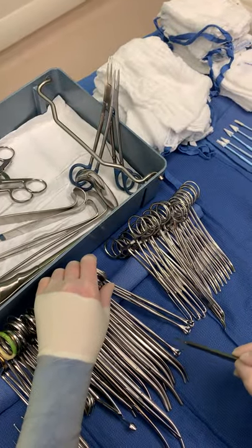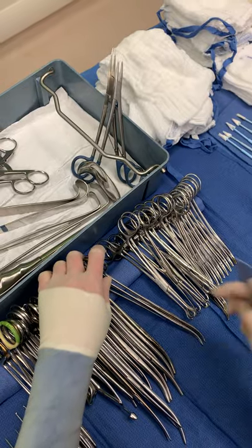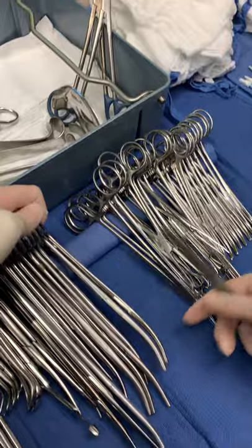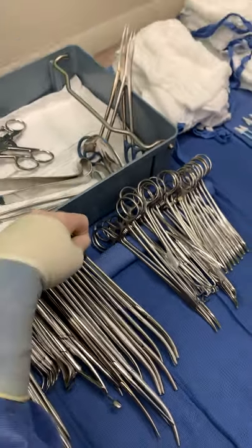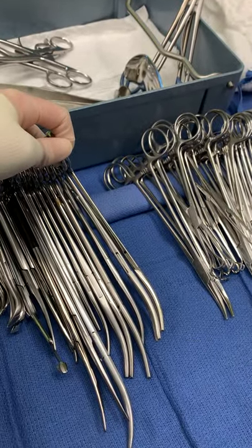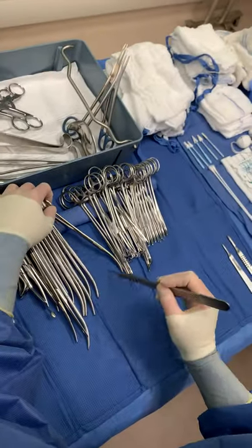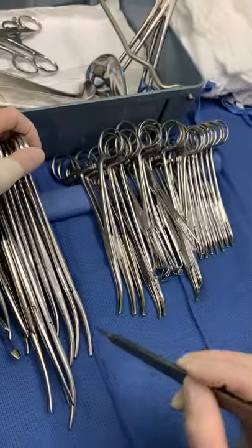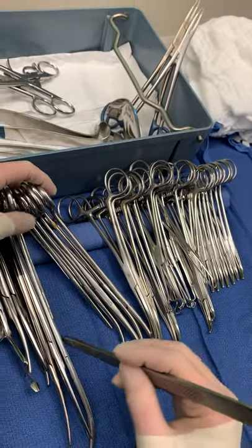Babcox, I have 1, 2, 3. TNAs, I have 1, 2. And then to check the tips of these, I'm going to lift it up like that, and I can see that it does not have teeth. So I know that that is a peon — I'm just lifting up right here and checking the tip, just to double check what it is, and my circulator can see it as well. So peons, I have 1, 2, 3. Ochsners or Cokers, I have 1, 2, 3, 4, 5, 6.